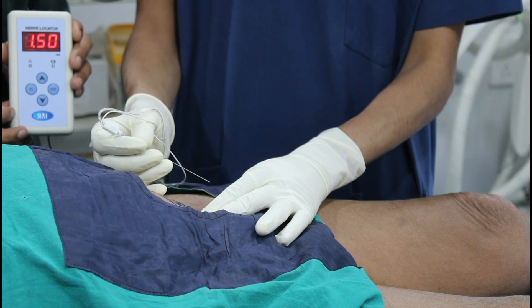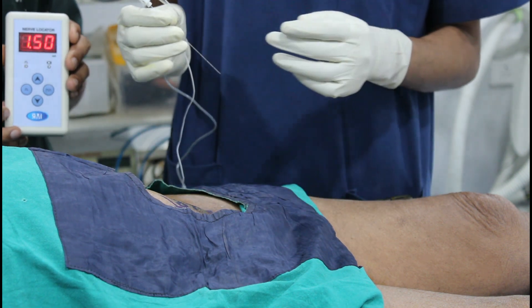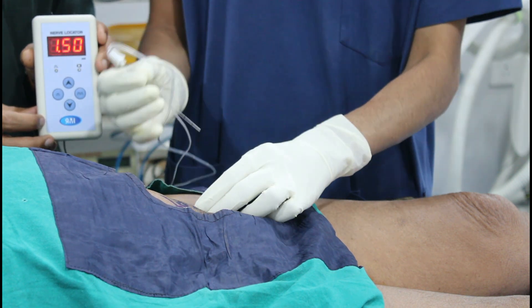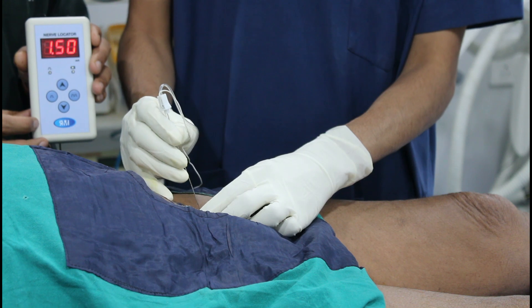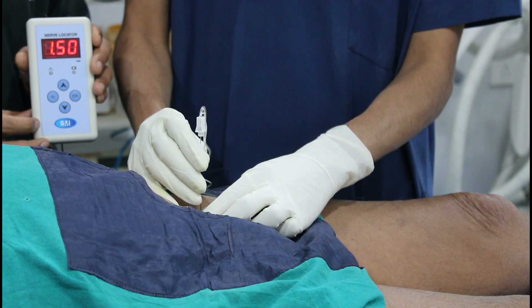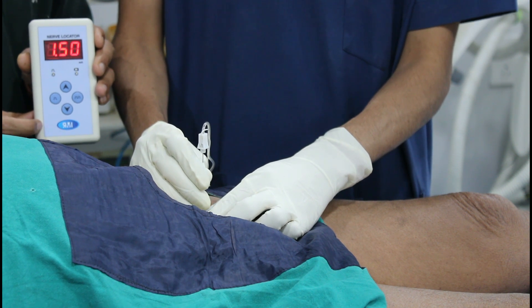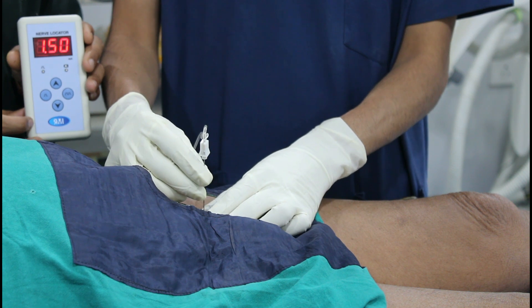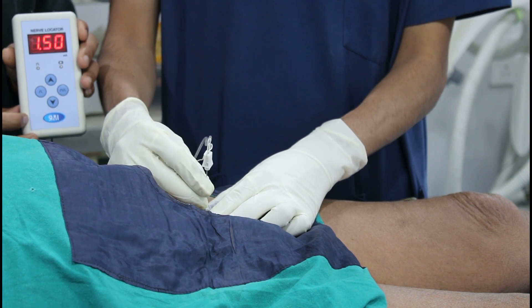Before giving the block, I have sedated the patient with 1mg of injection midazolam plus 50mcg of injection fentanyl to avoid the patient's discomfort. My needle direction should be perpendicular and slightly in the lateral direction.